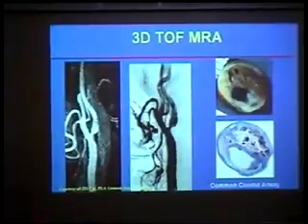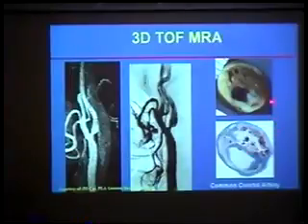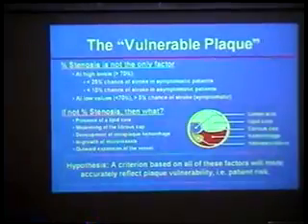These are some sample histology images of a plaque. This is really not coming from this one, but it's just an example of what we see if we start looking at a wall. And this is pretty much the gold standard of things. You can see a lumen here that is narrowed. This is where the plaque is. You also see that the tissue type within the plaque can be highly complicated, especially in the carotids, where this is a relatively large artery in humans.